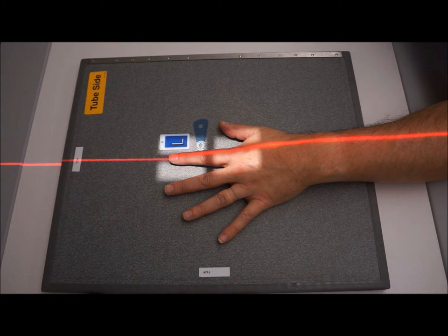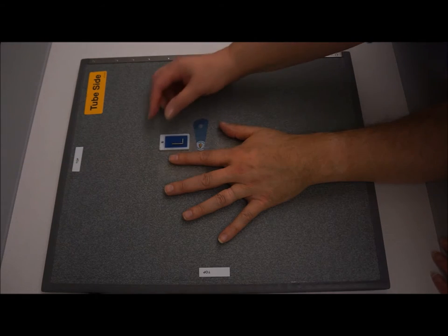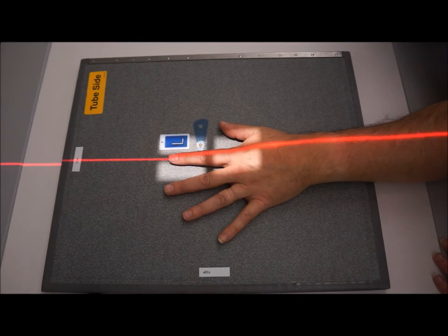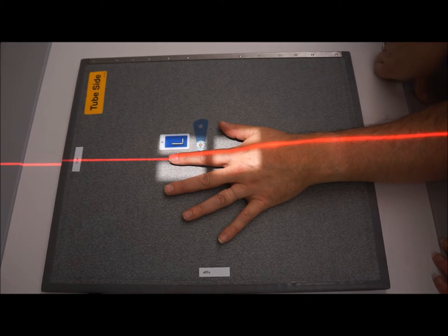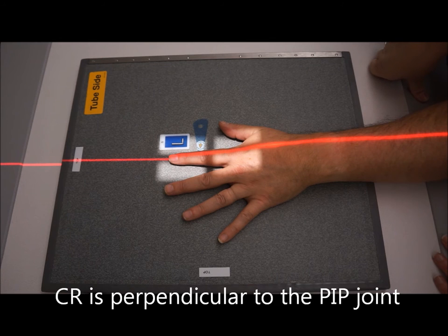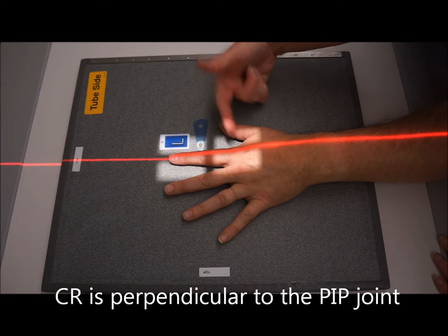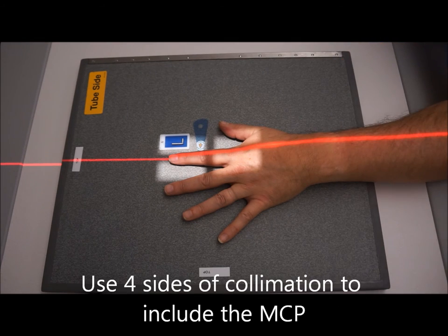This is a three-view second digit, so this is a PA second digit. We want the digit parallel to the image receptor with the central ray centered at the proximal interphalangeal joint. I do want to make sure that I'm including the metacarpophalangeal joint.